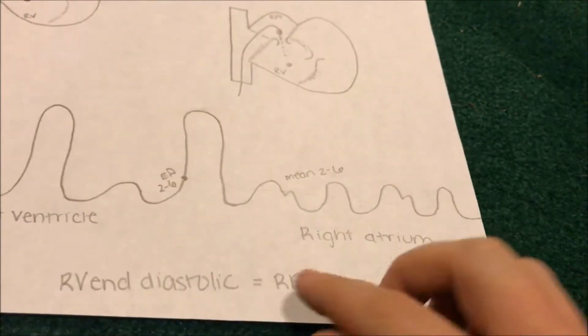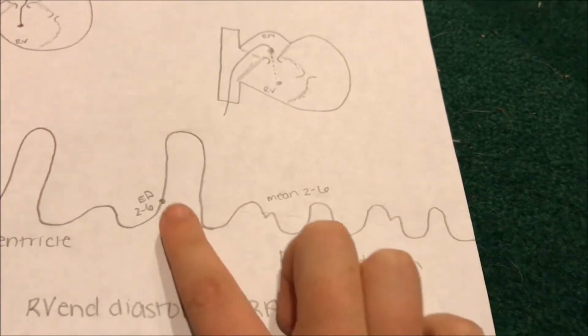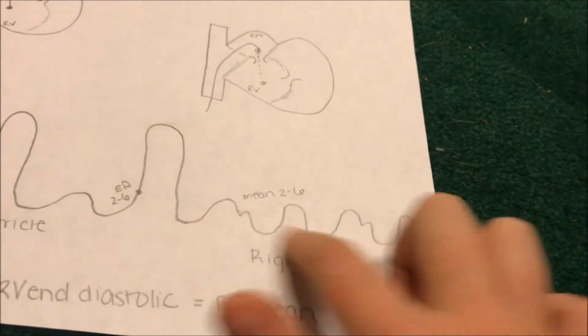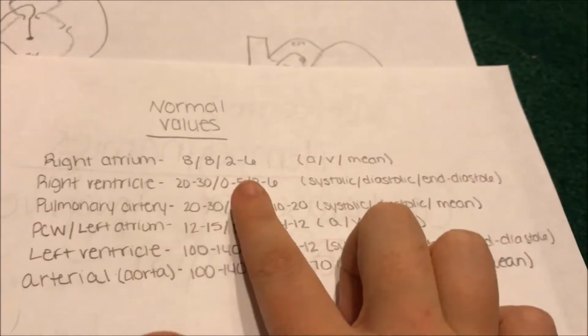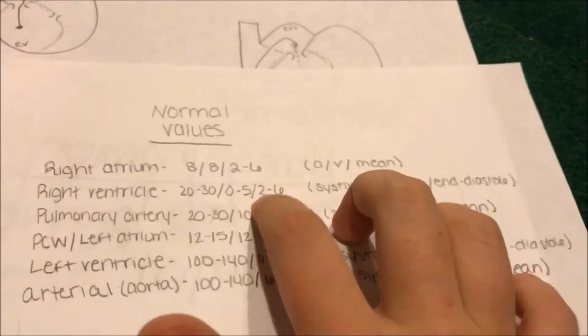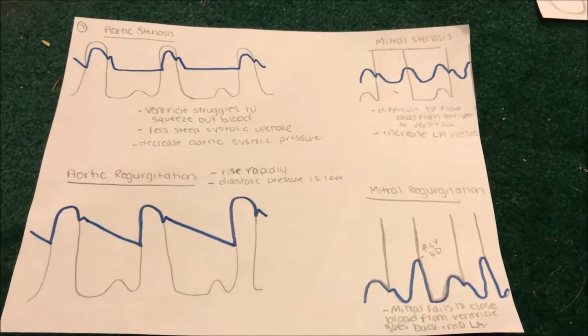The right ventricle end diastolic is right here with the right atrial mean. If we drew a line, it should be right around the middle of that right atrial pressure. The mean is 2 to 6. And if we take a look at this again, the right ventricle end diastolic is 2 to 6, the right atrium mean is 2 to 6, and that is how it correlates.